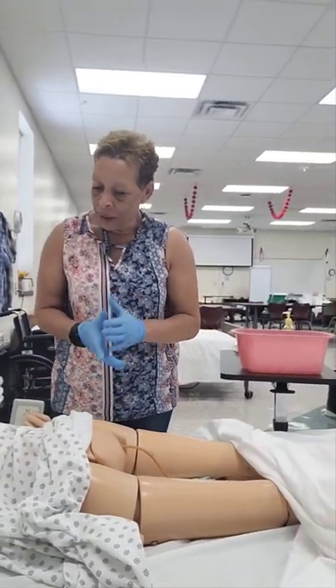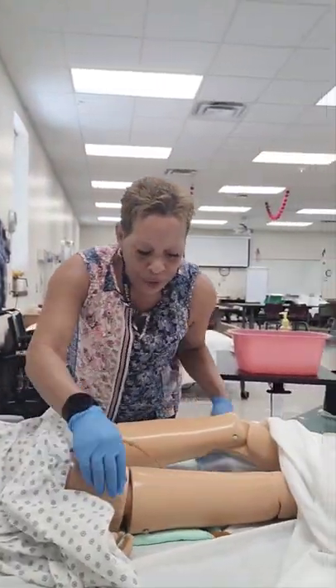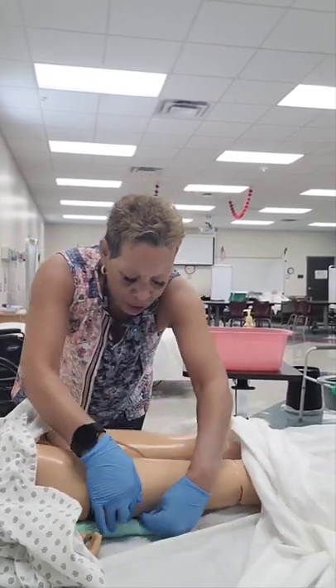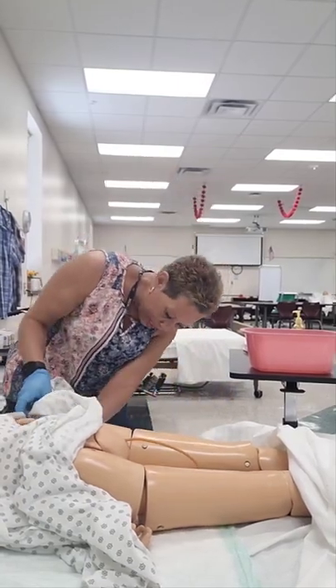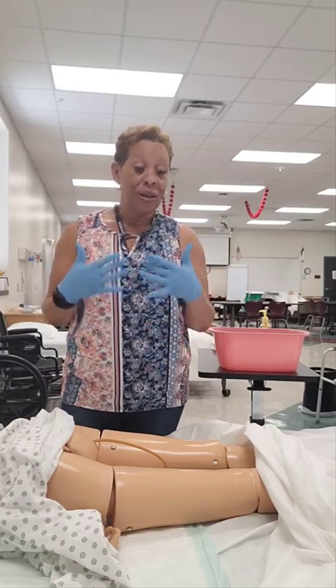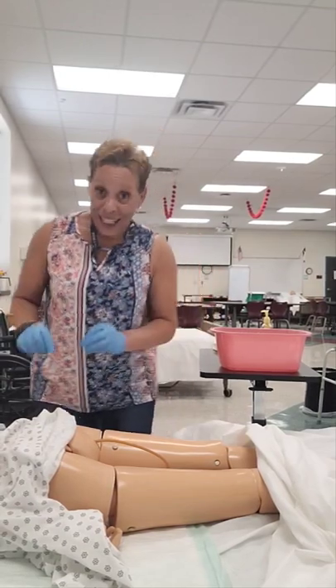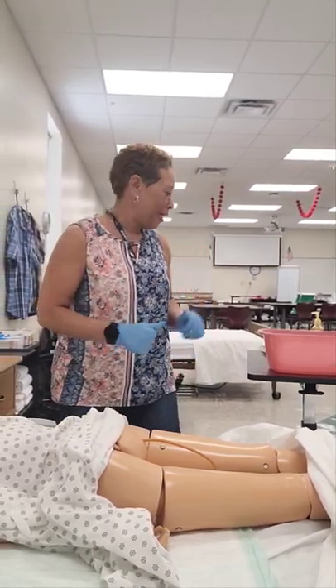On the count of three I'm going to raise your hips and pull the chucks through. If the testing site does not have a chucks, you can use a towel. One, two, three. Mrs. Jones, you can lower your hips back down. I'm just going to move your catheter and pull the chucks through. When placing the chucks, ensure it is completely underneath the buttocks and peri area — if you see the NAE walking around, check again to confirm placement.